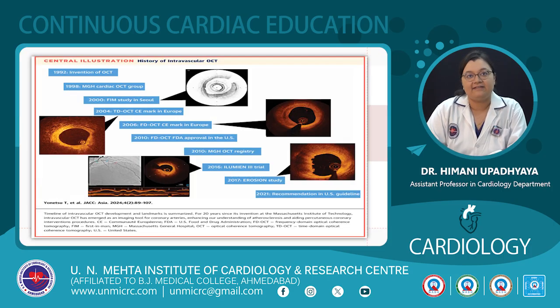Let's have a look at the history of intravascular OCT and how it gradually stepped into coronary intervention. It was invented by Professor Fujimoto in 1992. Then in 1998, the MGH cardiac OCT group was made for its use in coronary intervention. In 2000, the first in human study was done, and in 2004, time domain OCT got its CE mark in Europe.